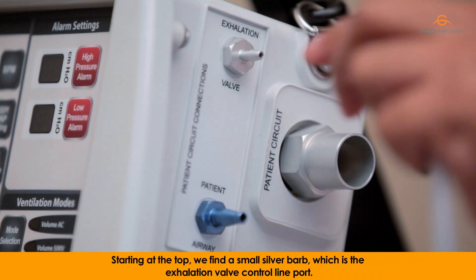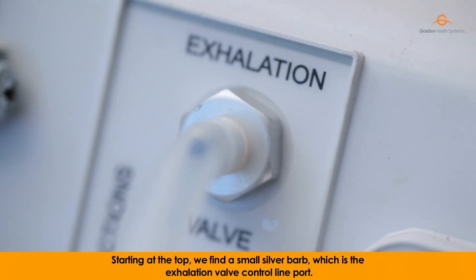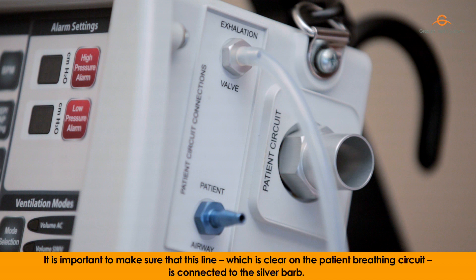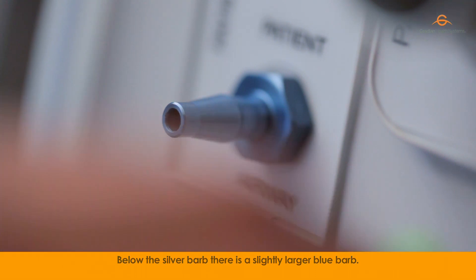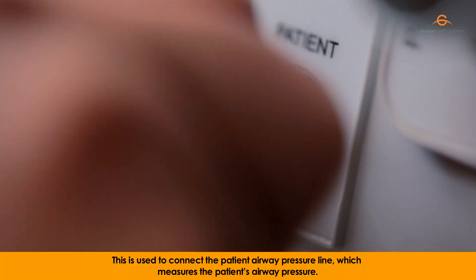Starting at the top, we find a small silver barb which is the exhalation valve control line port. This line is used to control when the patient is allowed to exhale. It is important to make sure that this line, which is clear on the patient breathing circuit, is connected to the silver barb. Below the silver barb, there is a slightly larger blue barb, used to connect to the patient airway pressure line, which measures the patient's airway pressure.